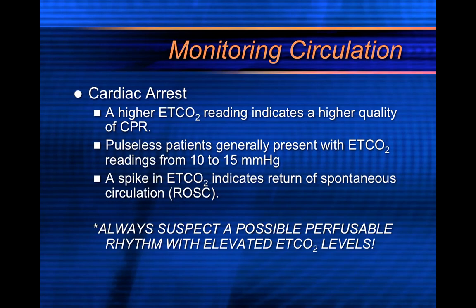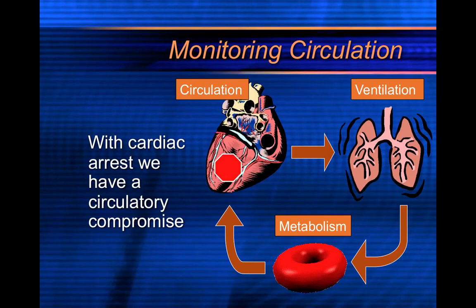How do you know you got a pulse back? Well, a spike in end-tidal CO2 is a good indicator. Obviously, you're going to feel for a pulse. But if you get a spike in end-tidal CO2 values on a cardiac arrest patient, that is a super good indicator of ROSC, return of spontaneous circulation. So suspect an increase in perfusion and possible perfusable rhythm with an elevated CO2 level.